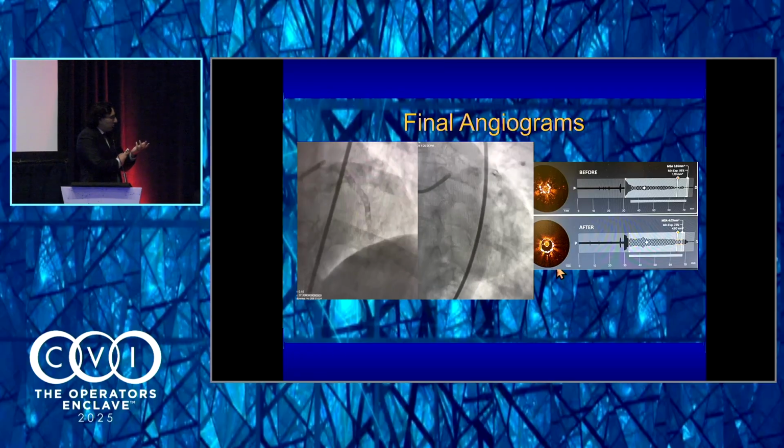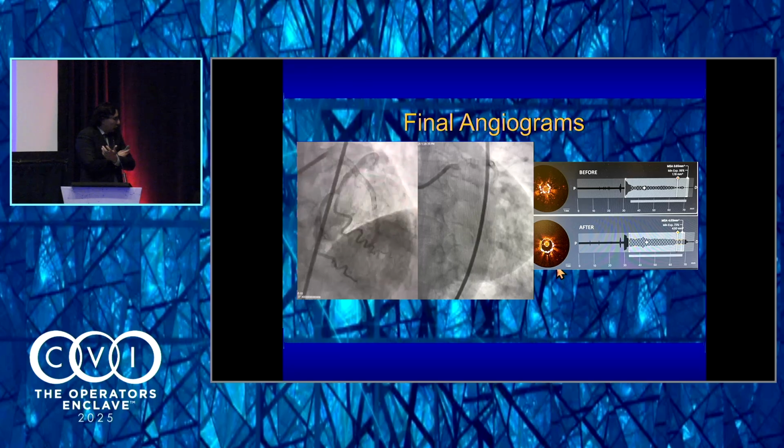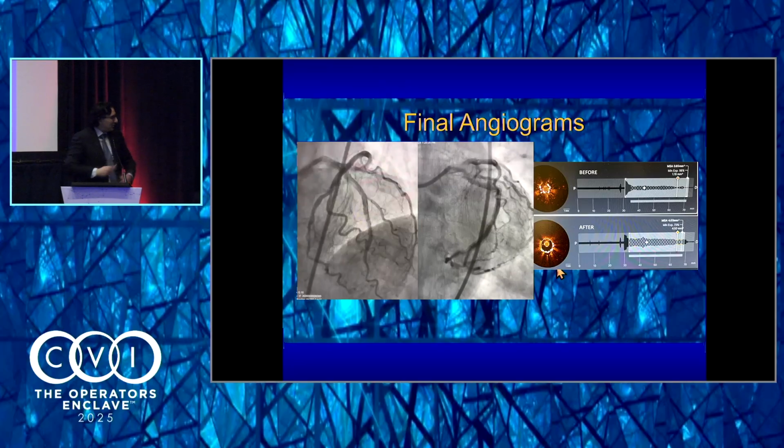Guys, would love to hear your opinions. 76-year-old female. I mean, minimal luminal area is now 4.5, so it's greater than 4 in a LAD vessel, mid LAD. I think she should not have symptoms with that.